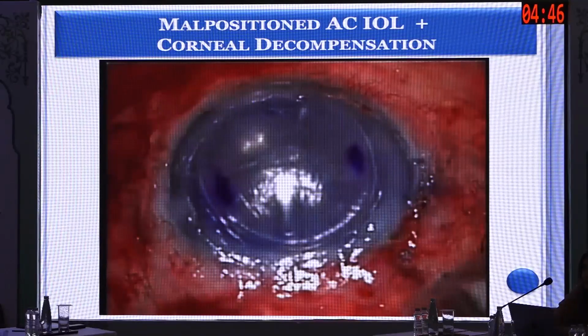A better flange is formed with the help of PVDF haptic. But when you are doing a glued IOL, maybe with practice or whatever, there's no problem when you're using a PMMA haptic.